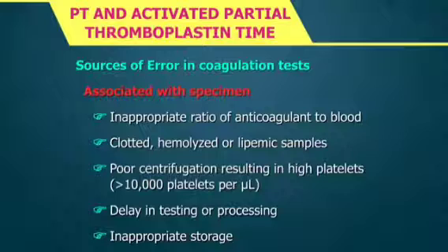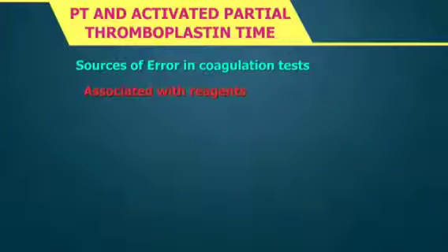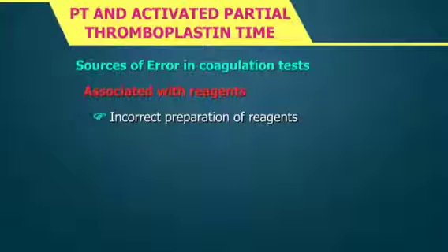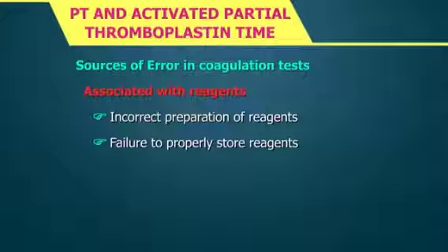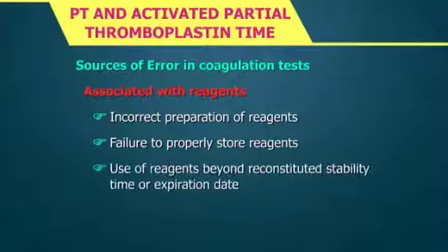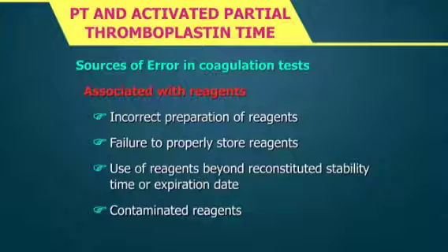Inappropriate storage. 2. Associated with reagents: incorrect preparation of reagents, failure to properly store reagents, use of reagents beyond reconstituted stability time or expiration date, contaminated reagents.